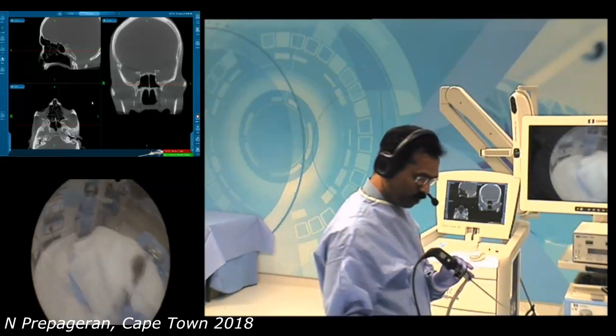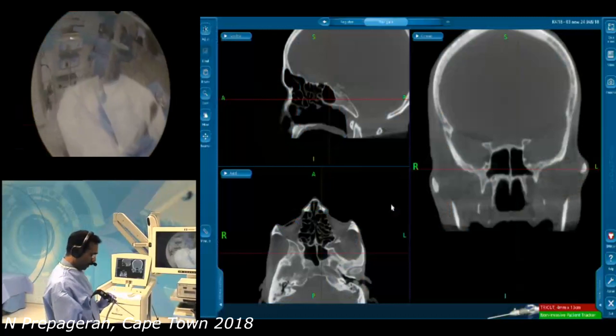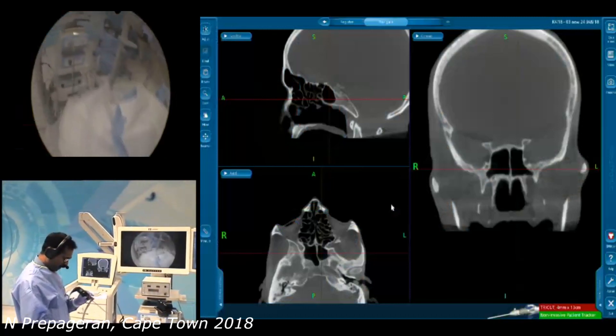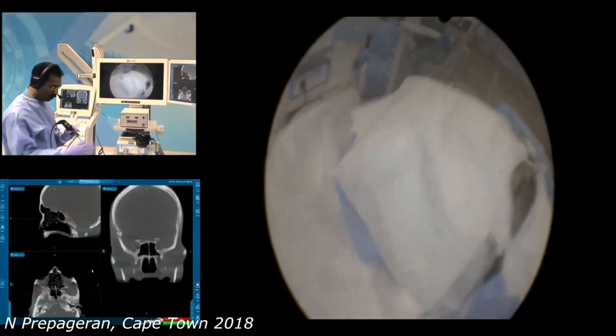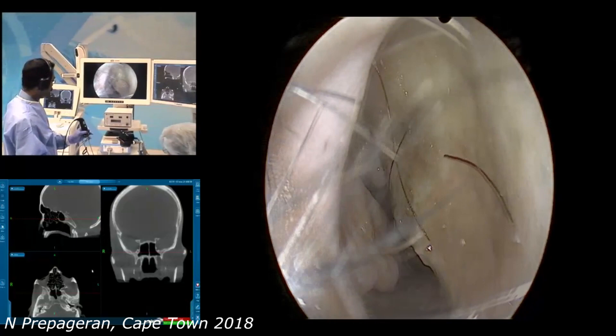So, let's start with the surgery. You can see that the patient is tilted up slightly. I like my patients to have a slight extension of the head — it can be neutral if you want to. And some other basic points.